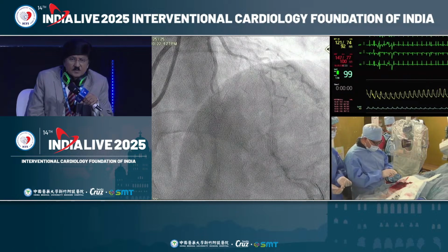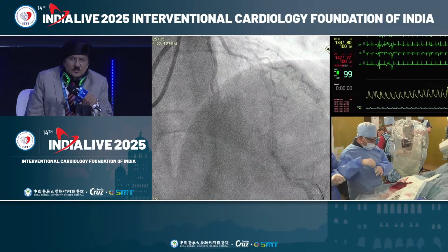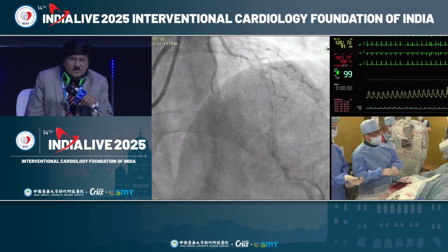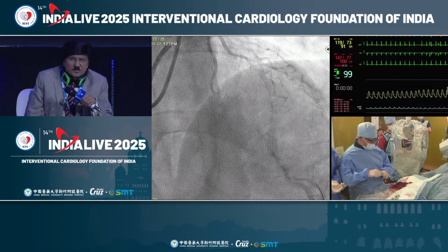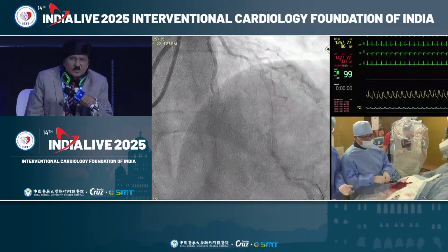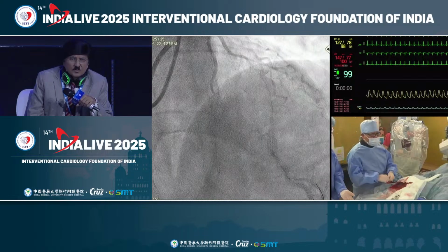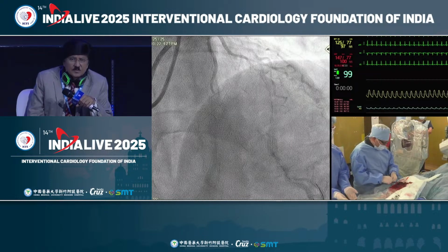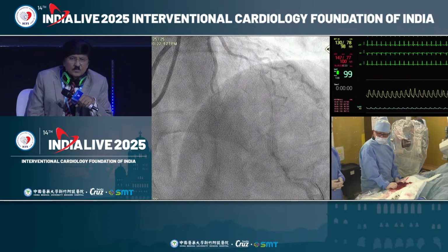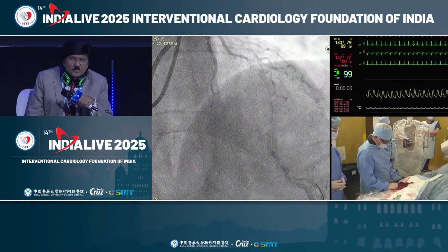But 5 years ago, I evaluated a lot of IVUS images. Then if we set it lower than 140,000, sometimes the burr makes a vessel injury. Of course, without perforation, but some injury there. So I have never used less than 140,000 after that.